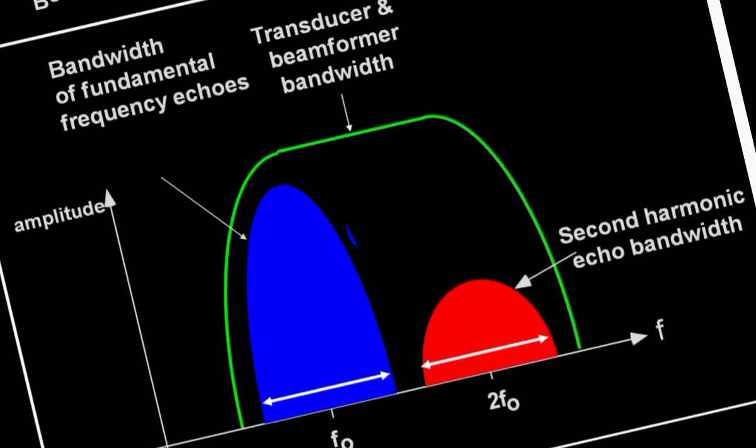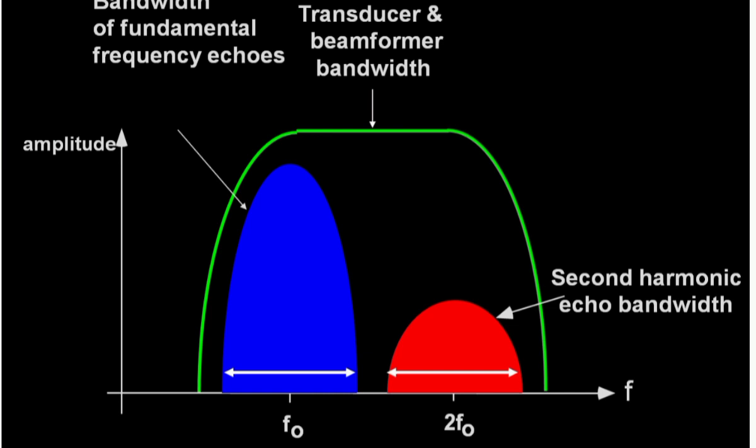Let's look at tissue harmonic imaging. You know that a normal ultrasound beam consists of a range of frequencies, like we said in the last few lectures. From this range of frequency, the lowest frequency component is called the fundamental, or what you call the first harmonic. Conventional ultrasound imaging requires the transmission of an ultrasound beam at the fundamental and also receives the reflected echo at the same fundamental frequency.